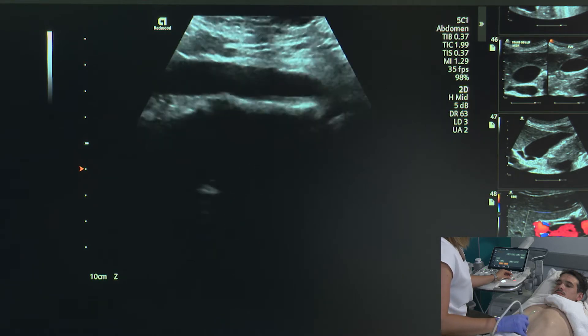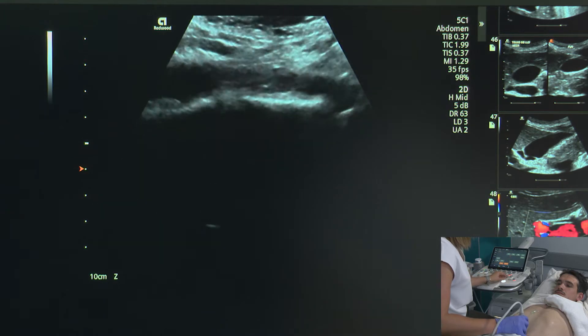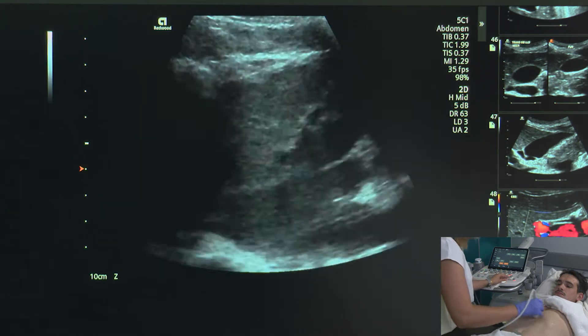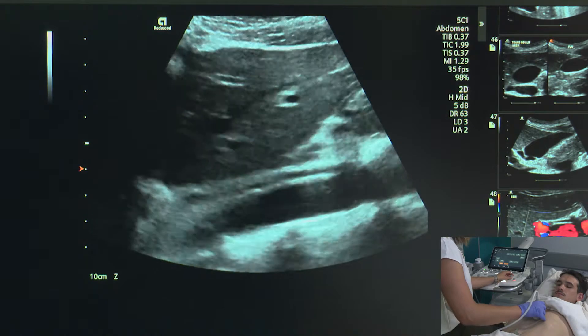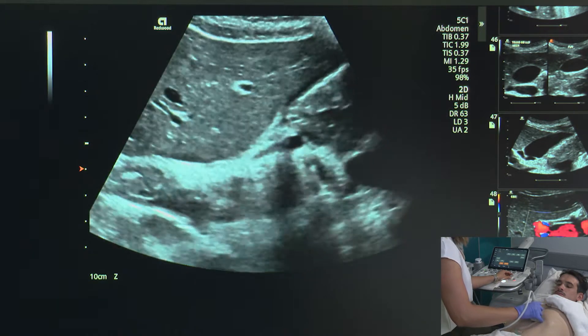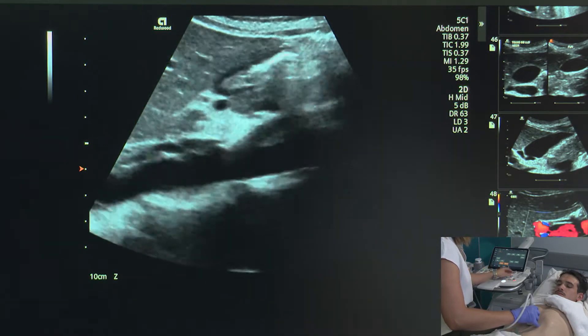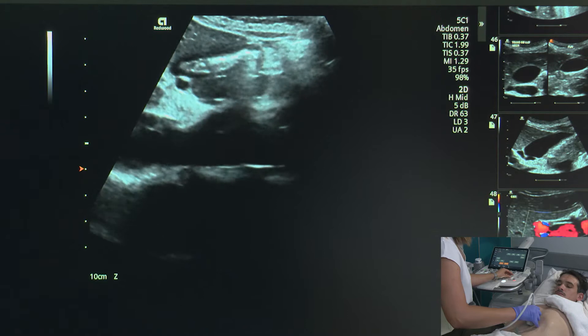There we go — until you see it tapering there, which is where we have our bifurcation. I'm going to do one more sweep all the way down, sweeping to the side through the aorta, which is right here — that really strong tubular structure.